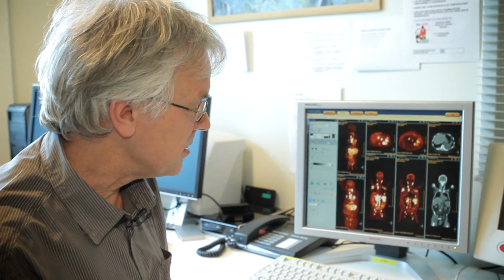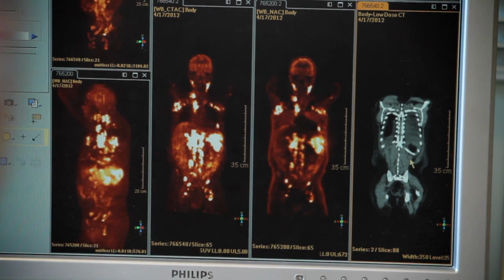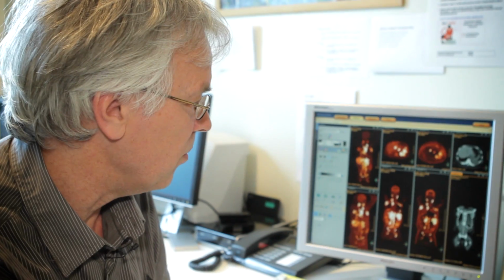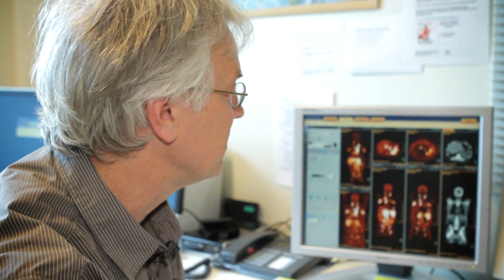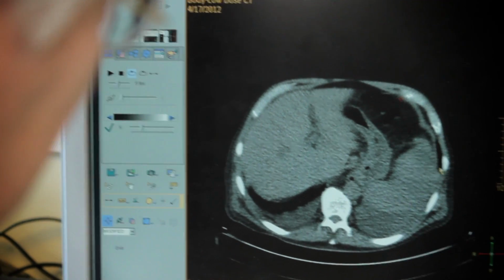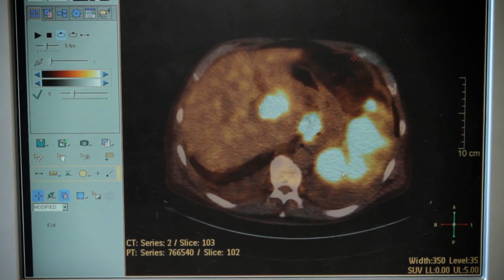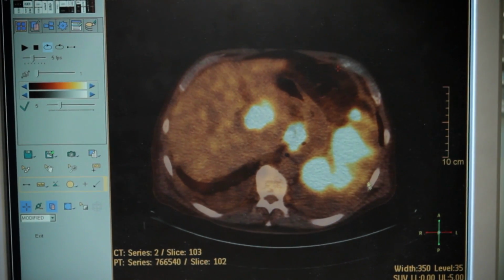As an example, I have here images of a patient with lymphoma, so that's lymph node cancer. This is the CT component. This tells you whether there are anatomical abnormalities, enlarged lymph nodes or any other kind of abnormality of shape and size. So what the PET information adds to this, and those are the colored images here, is whether abnormalities seen on the CT scan represent disease or not. So we can fuse the images, put them side by side as an overlay. Here we are looking at the liver, here's the spleen, and here's something we can't tell from the CT what it is. Now we add the PET information and we see that this is diseased, all of this is diseased, inside the spleen, inside the liver, and this, which was abnormal at the CT, is normal at the PET scan.